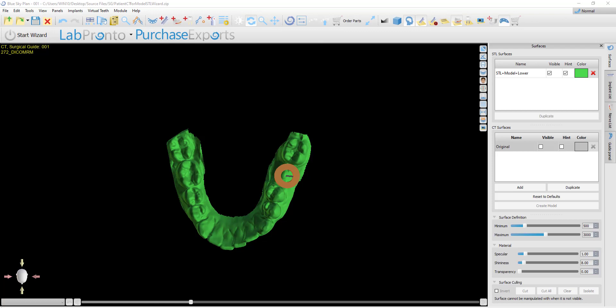In previous versions of Blue Sky Plan, in order to make sure the surgical guide can be inserted into the patient's mouth, we automatically removed undercuts from a top view of the model. While this was done automatically and behind the scenes via the software, the user, when designing the surgical guide, was not able to change the angulation of the path of insertion for which the undercuts should be removed.